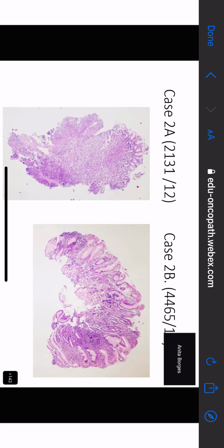If you can see it, please mark it. Where is this extravasated mucin? All this, ma'am. That's not extravasated mucin. That's just some sort of serous exudate, or even something that's crushed by the biopsy. That's not extravasated mucin. Okay, ma'am. So nothing else you can see.